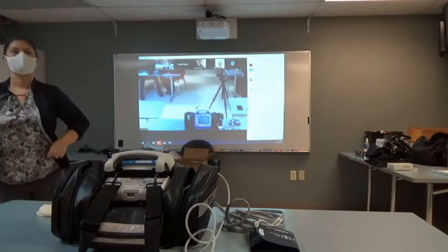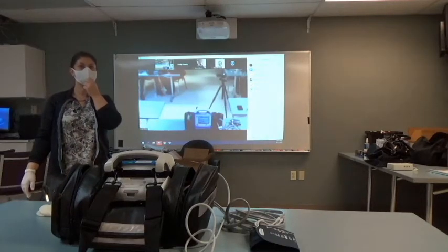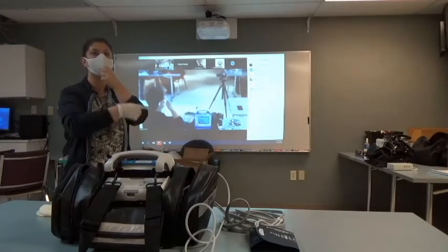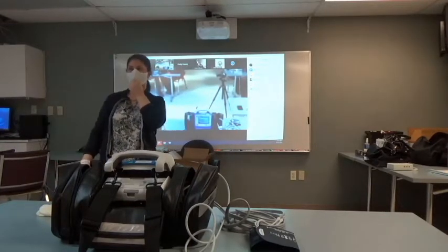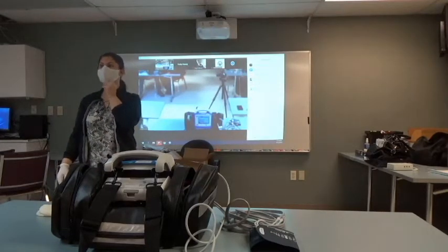When you disarm it, does that mean that the next time that monitor gets turned on, it'll automatically go back to every 5 minutes? It's just going to cancel that one reading out. Just the one reading. And then at 5 minutes, it'll try to take one again, at another five. Yes.